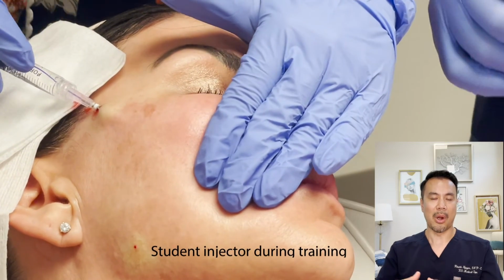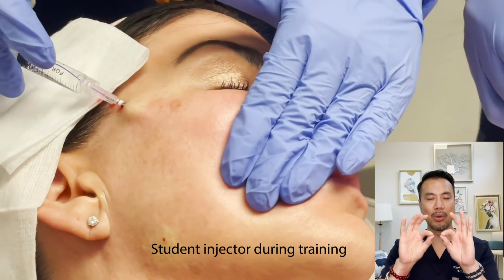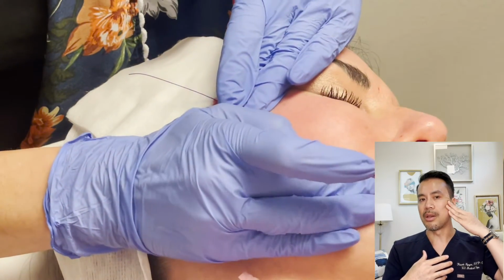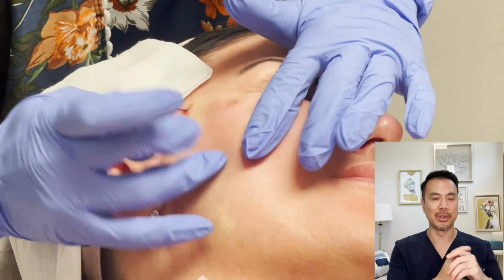When I do the procedure, I'll always cut the threads and give that thread to the patient and let them feel it. You'll feel little linear spikes on them. When I place them into certain places and lift the skin up, rather than the skin dropping back down, it catches on those little spikes, holding the tissue up. With molded, still a monofilament, but rather than spikes, which I'll show in the picture up here, they're stacked on top of each other. They're molded. They look more like a Tetris piece than a little linear cut barb.